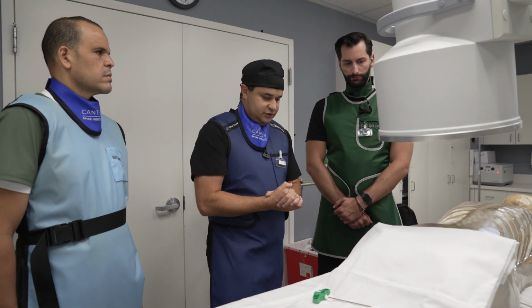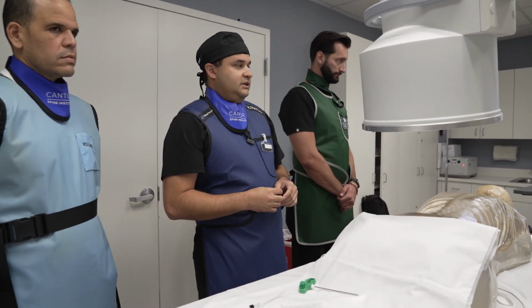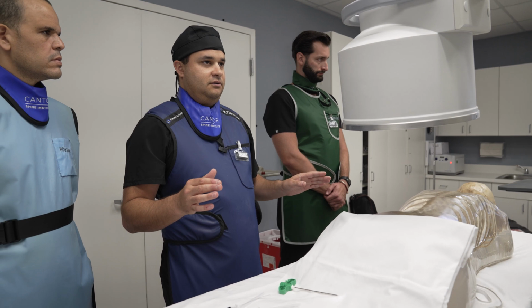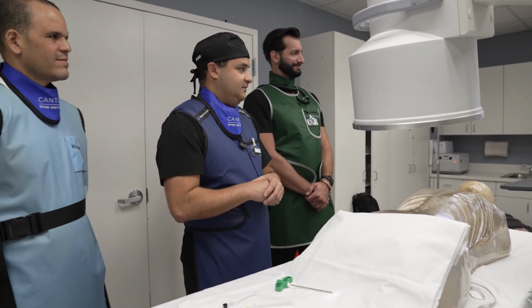So let's show off just a 1 level. Shoot that AP again. Perfect. Come north a little bit. We're going to go above. For their first transforaminal, I'm not going to make them go around a fusion. That's not always fun, getting around the bars. It's not impossible though. You can still do it.